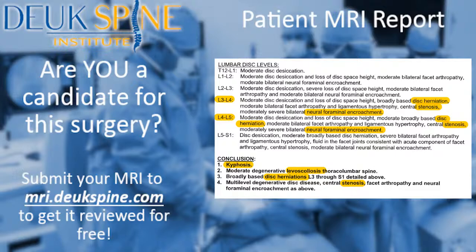And Sean, are you going to do the MRI review? Yes, we have it up on the screen now. If you look at the two levels that we'll be operating on today, L34, L45, both have disc herniations, neuroforaminal encroachment, which means nerve root encroachment, and spinal stenosis. They also have kyphosis and scoliosis, which shows you that this surgery can be performed even if you have deformities of the spine.